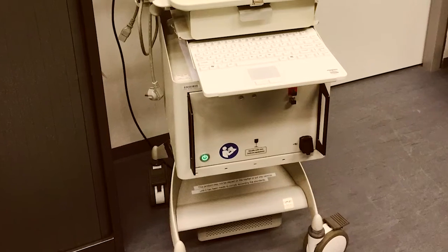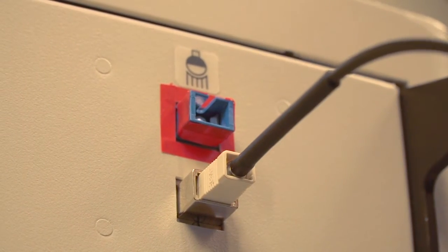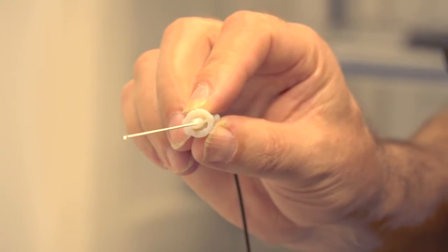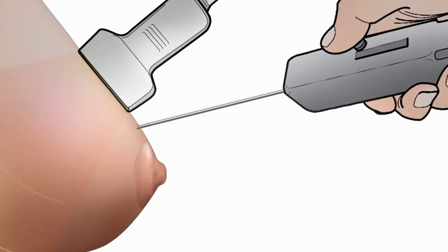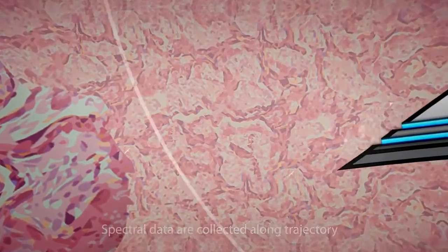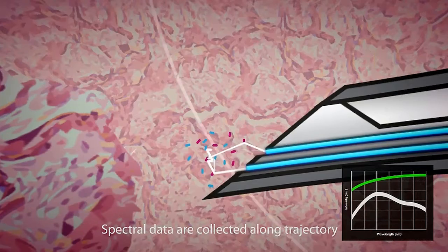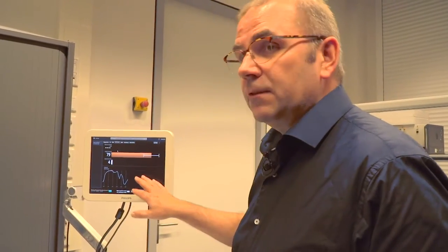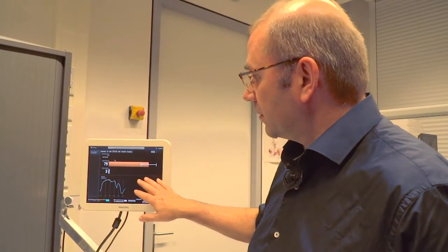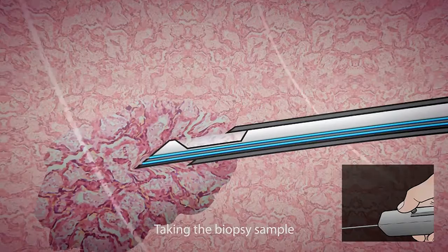This is a spectral tissue sensing system, which is a box indicated here with a light source. And that light is connected via fibers to the end of a needle tip. You shine light into tissue and light is scattered and absorbed, and part of the scattered light is then detected via a second fiber integrated in the needle. And what the device does is translate that into a spectrum displayed on the screen, which can be identified and which can be seen in real time by the physician.